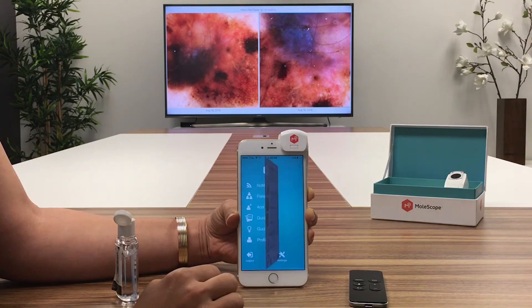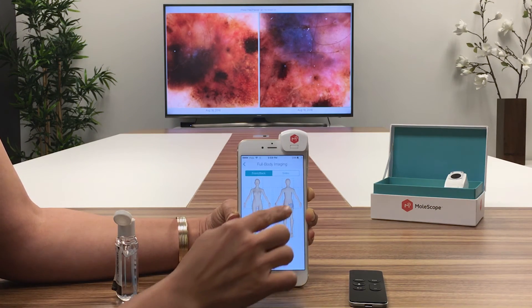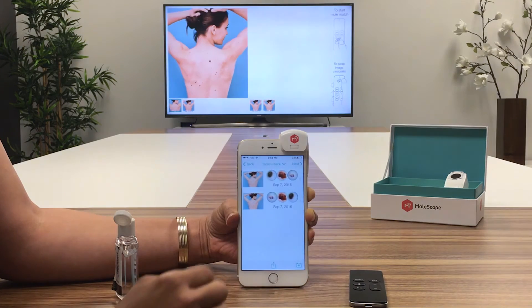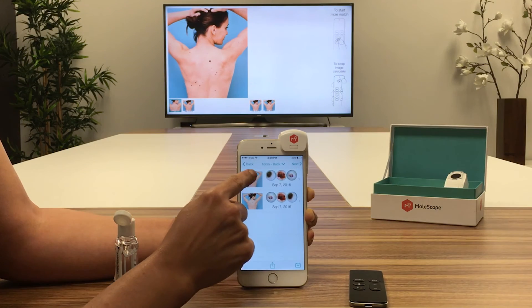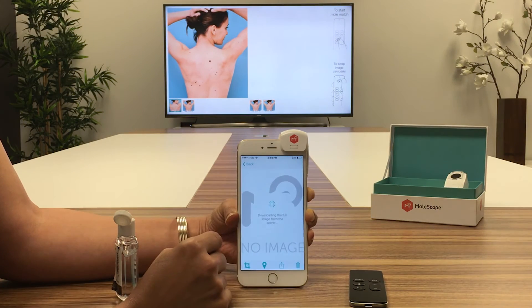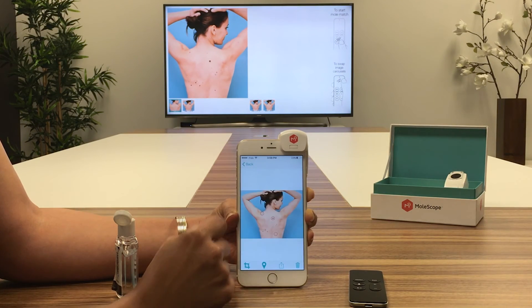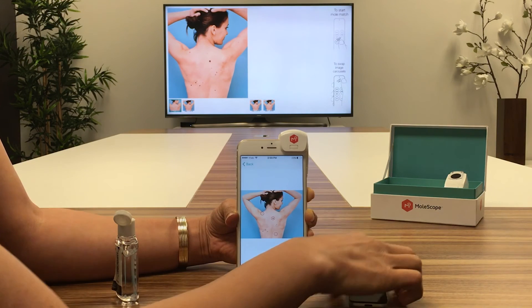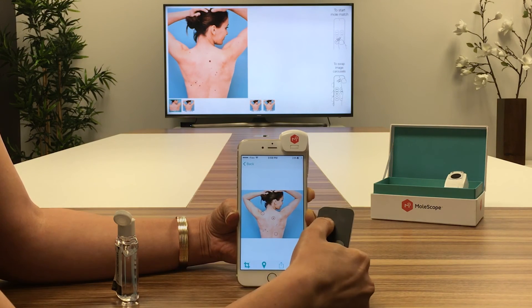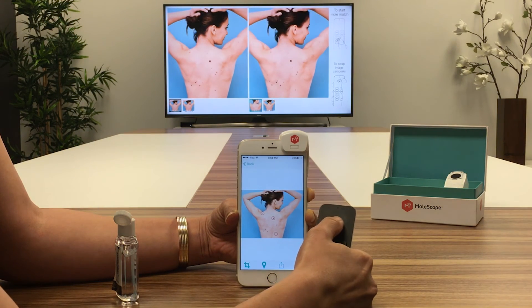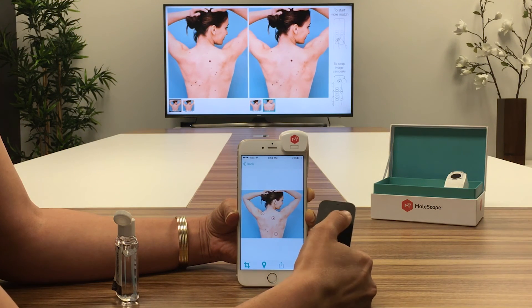The mole match and full body imaging tools can be used to analyze high level images on the big screen. Images are compared over time and corresponding lesions are matched to help detect new or changing lesions.